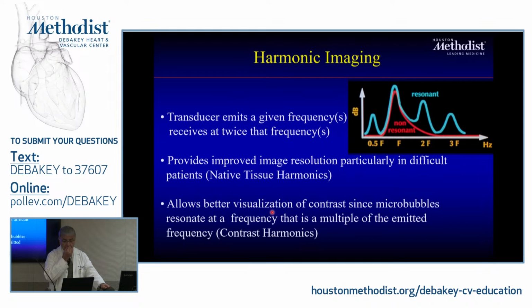Okay, harmonic imaging. What is that? Well, think about if I send a fundamental, let's take 3 megahertz. I'm imaging with 3 megahertz. If you hit a certain structure with 3 megahertz, interestingly enough, it will resonate, and it may produce multiples or a fraction of the actual frequency.